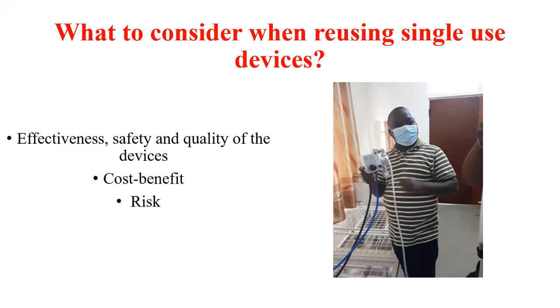Some of them are no longer appropriate to use. You will see some facial masks with dissolved valves. There are no longer those valves of exhalation and inhalation. At that time, they are not safe for the patients, and also they are not effective. So there are also cost benefits and risks. When we are reusing a device, please think on those.